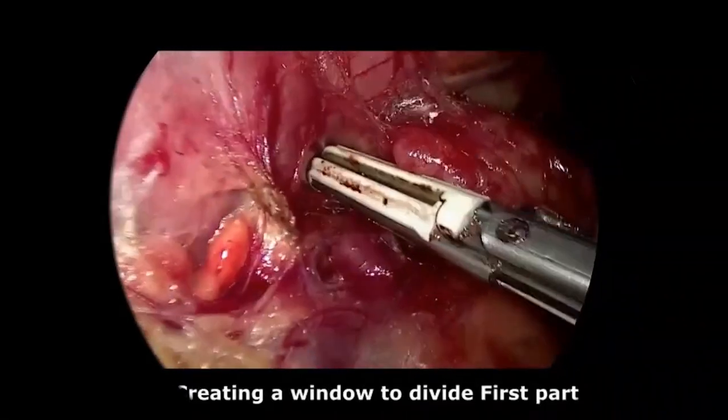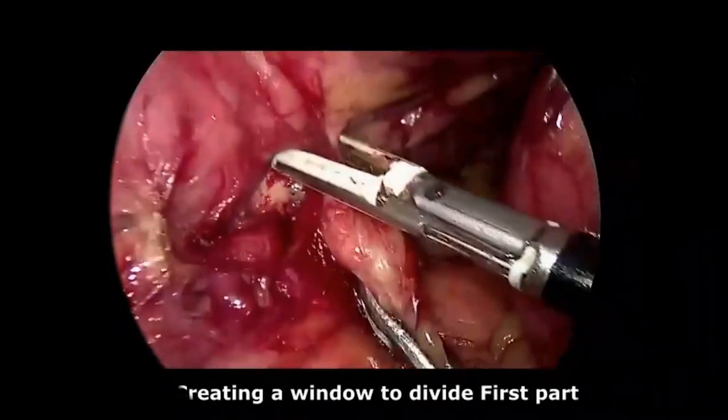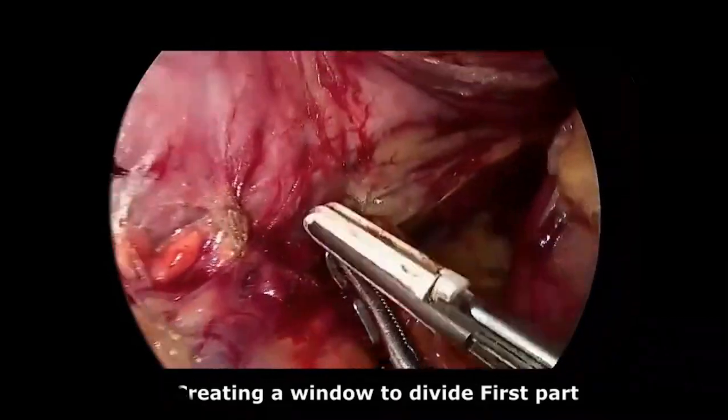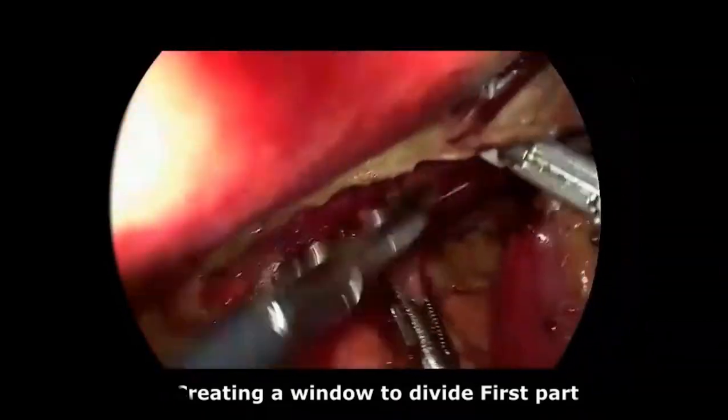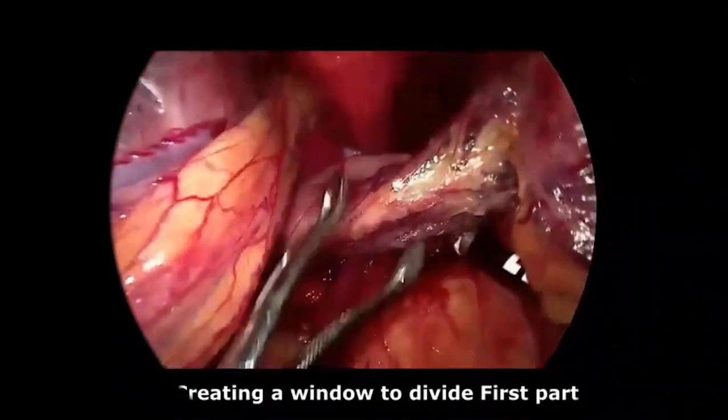Now, again, some blunt dissection from below. Then we will look from above. Here I am dissecting from below the duodenum. In this step, it is very important that the duodenum is vertical. When it is not vertical, I hold it closer and get it vertical. Then look from above.